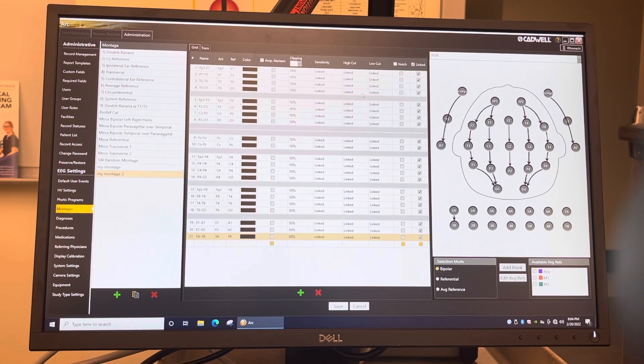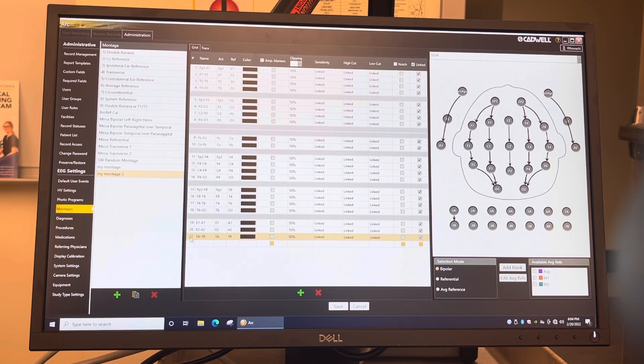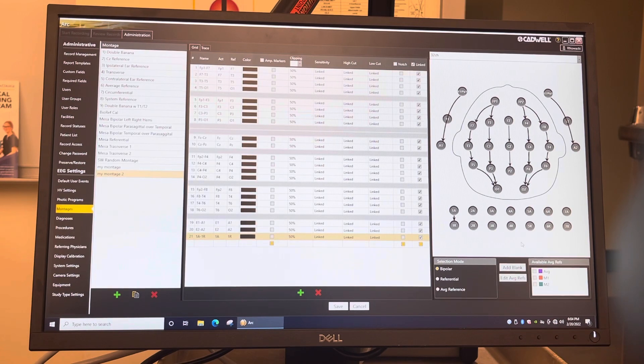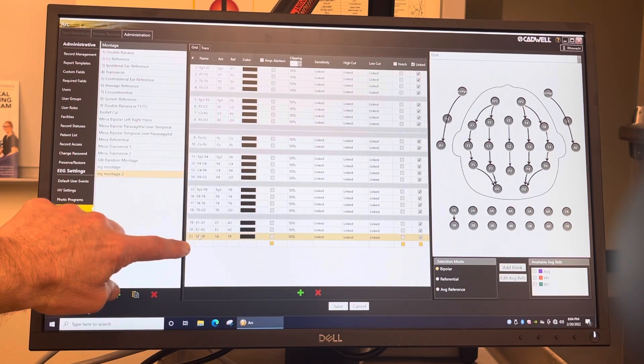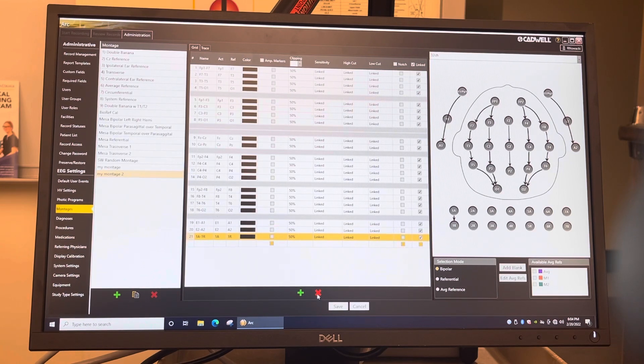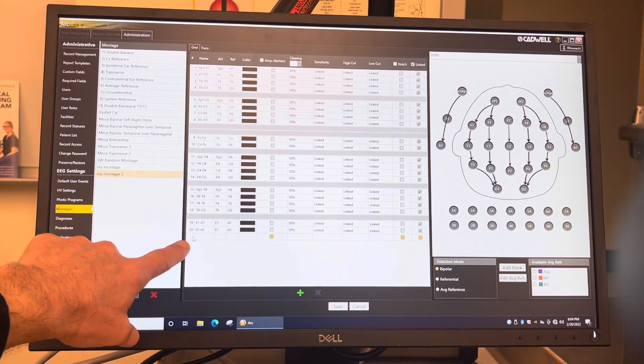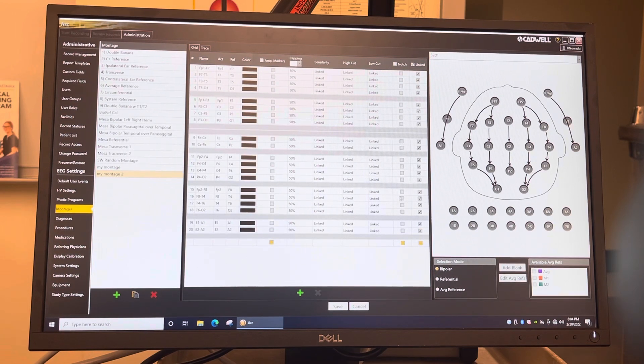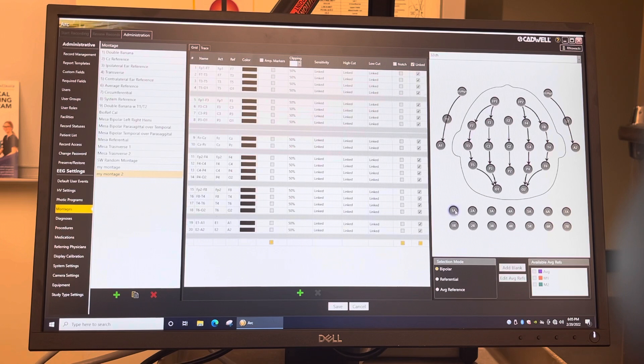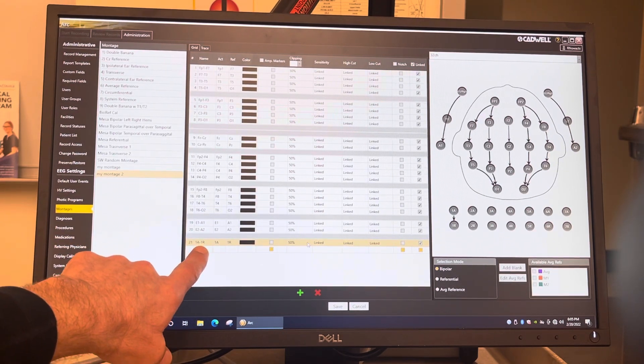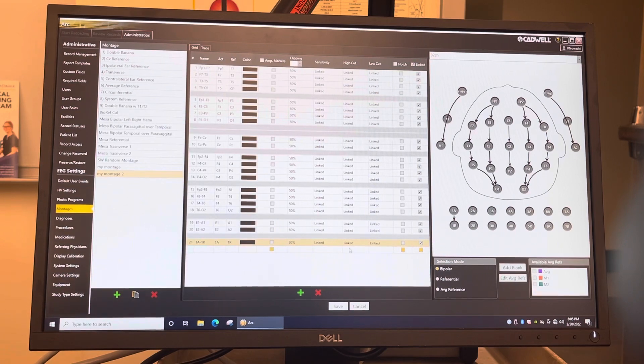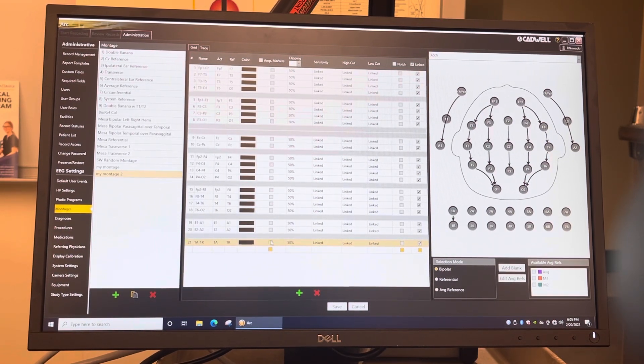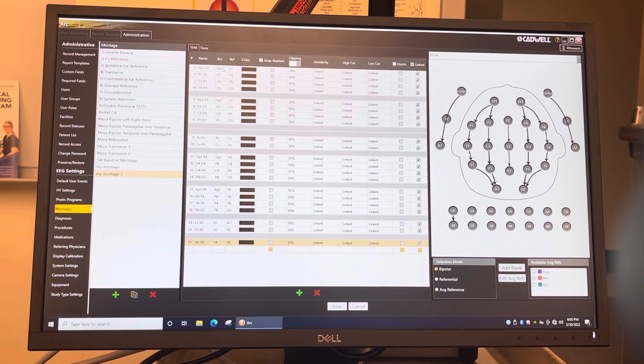The important thing on this is, actually we didn't put a blank in between the eyes and the EKG. So what I'm going to do is I'm going to delete that trace, that EKG right there. And then I'm going to add a blank. And then I'm going to go down here and I'm going to go 1A to 1R for EKG.